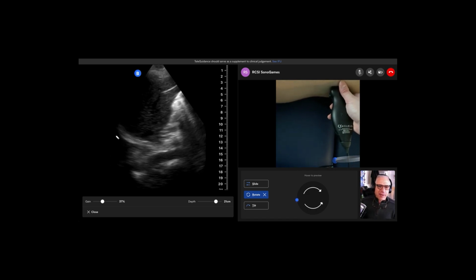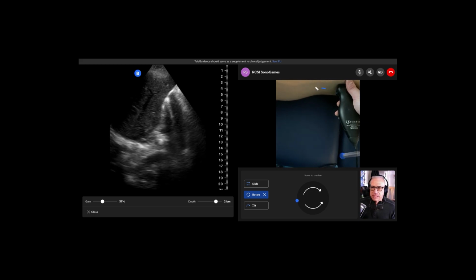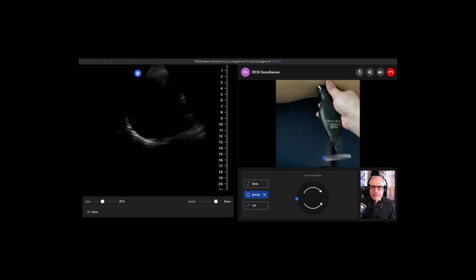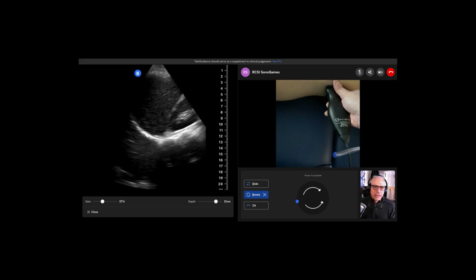Okay. All right. So go ahead. You had a fantastic view. So I think you want to slide a little bit this way, a little bit back up. Okay, back up. And then see if we can find that kidney again. There. Sweet. So now this is beautiful, right?